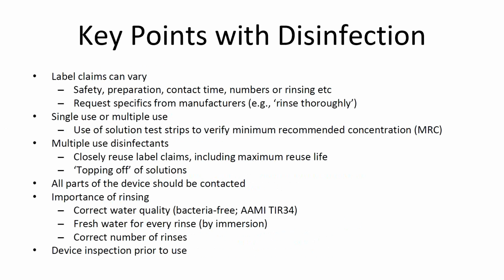All parts of the device do need to be submerged in the disinfectant, and if you're reprocessing them manually, then the channels do need to be filled with disinfectant using a syringe in order to make sure the internal spaces of the channel are perfused with the disinfectant fluid. And then we let it sit for the required contact time and at the proper temperature as noted on the label. And after that, it's recommended that you purge the endoscope with air to remove residual disinfectant, and then we move on to rinsing.